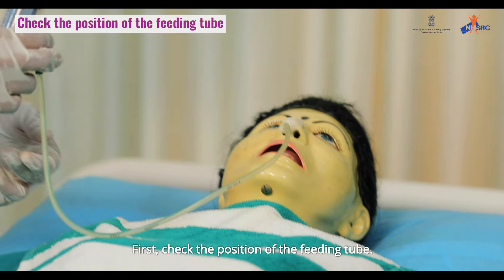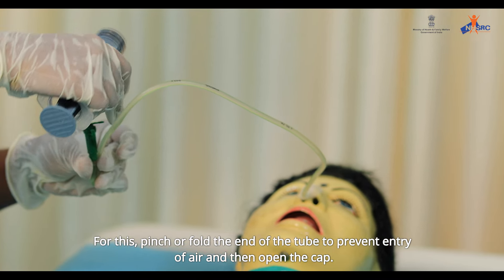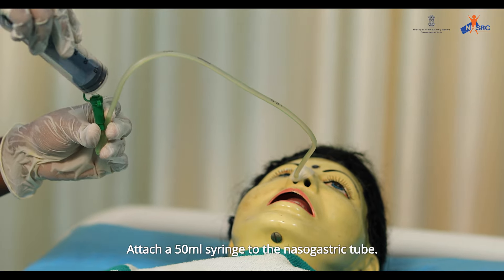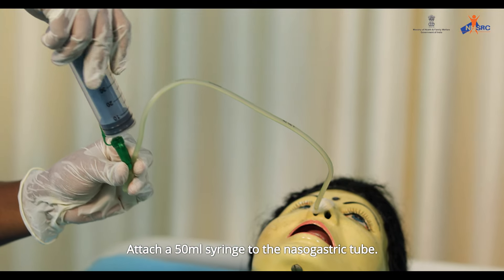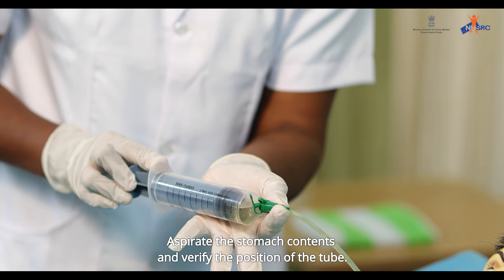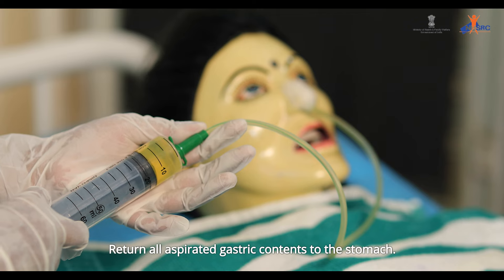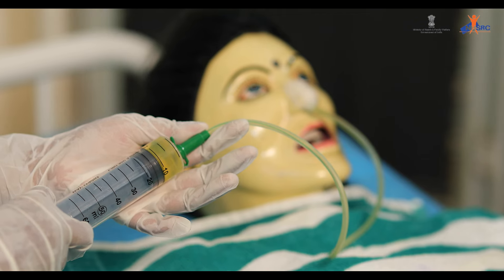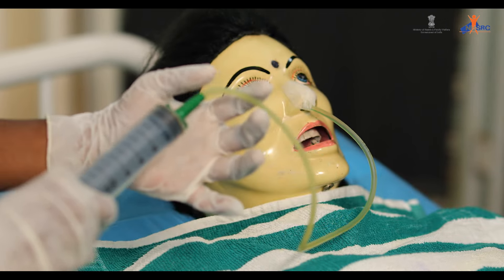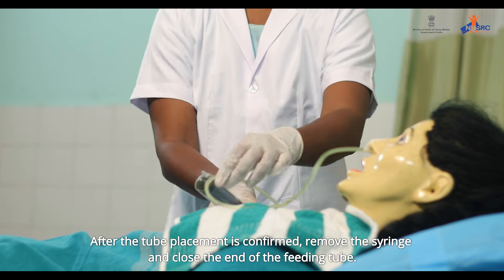First, check the position of the feeding tube. Pinch or fold the end of the tube to prevent entry of air, then open the cap. Attach a 50 ml syringe to the nasogastric tube. Aspirate the stomach contents and verify the position of the tube. Return all aspirated gastric contents to the stomach. If the aspirated fluid is less than 50 ml, feed can be given. After tube placement is confirmed, remove the syringe and close the end of the feeding tube.